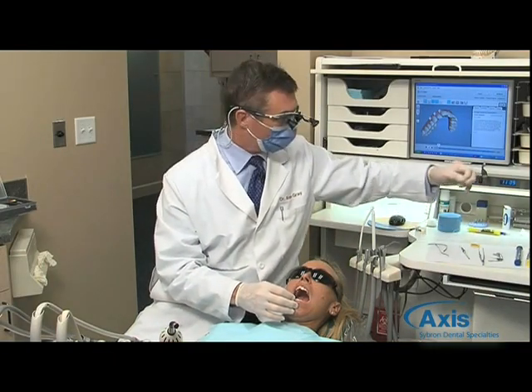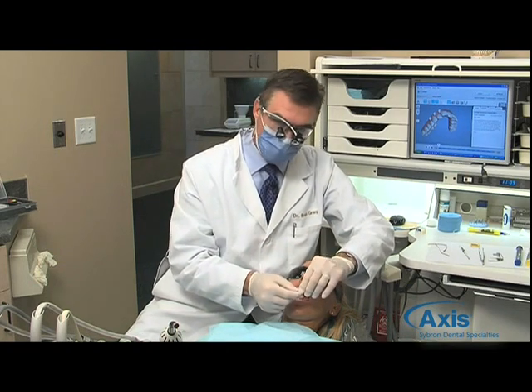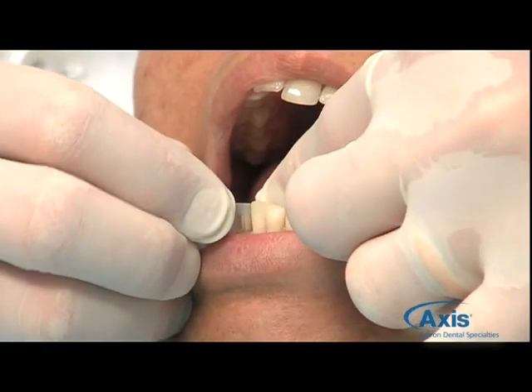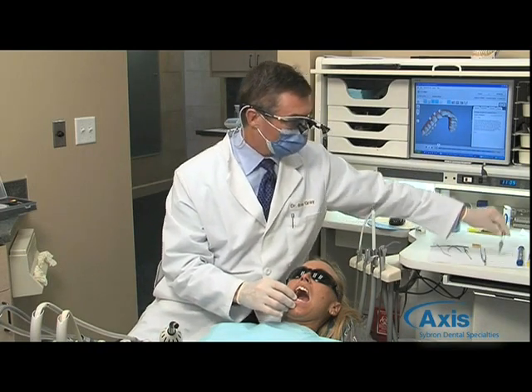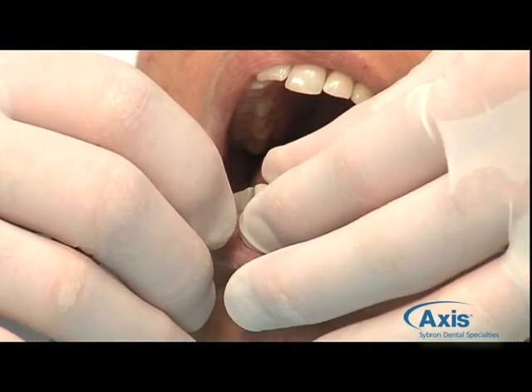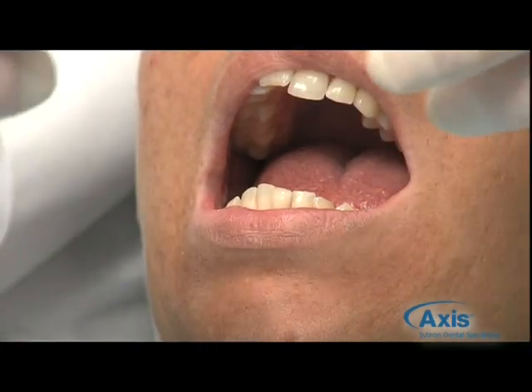Finally, if it feels like a very tight contact, I may actually even go to doubling up the blue, which is 0.125 plus 0.125, or 0.25 total, and work that in through there, just so it passes rather tightly, but passes through. Finally, I'll go to the gauge, and I'll measure to see that I took away 0.2 millimeters of space. When the gauge passes freely between the teeth, I know that I've accomplished my goal.